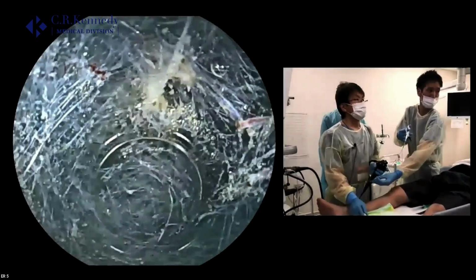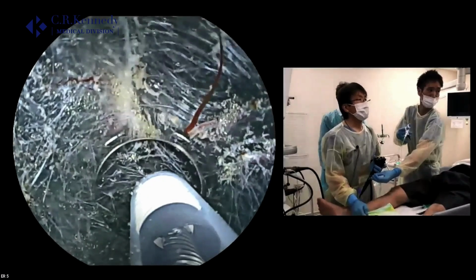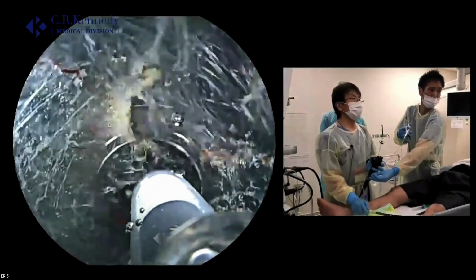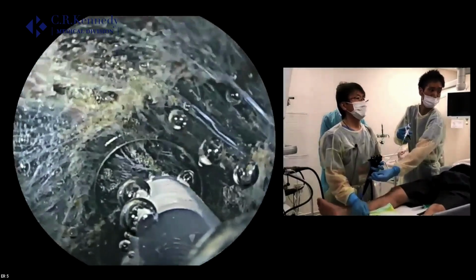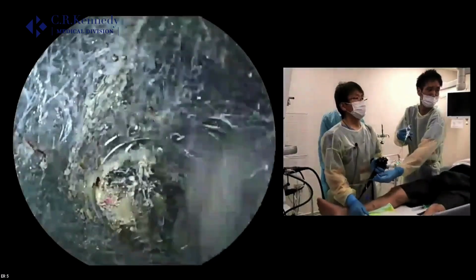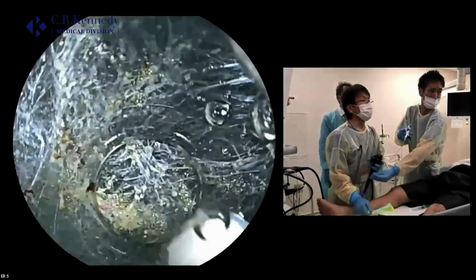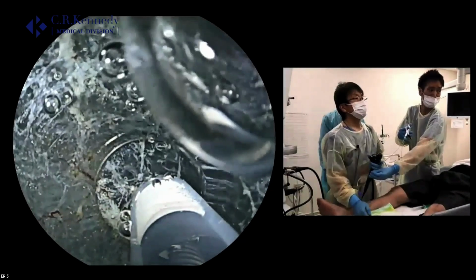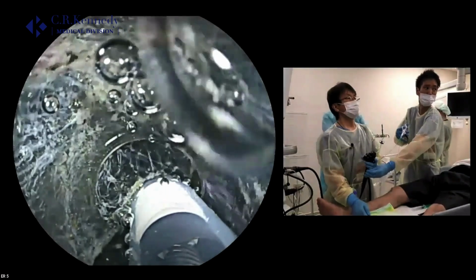So as long as the endoscopic view is clear, we can see the blood vessel clearly, and we can see through the muscle layer. And in the submucosal pocket, the endoscopic control is very stable, so the dissection is easy. So this side is the muscle layer. We can see through the muscle layer, leaving a little bit of submucosal tissue on the muscle side, and dissect.